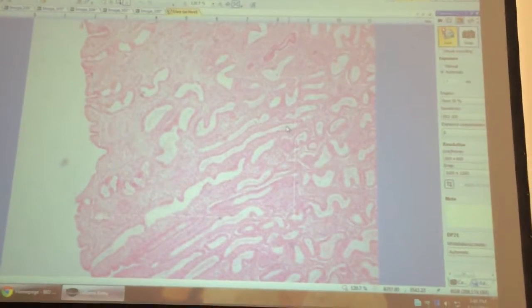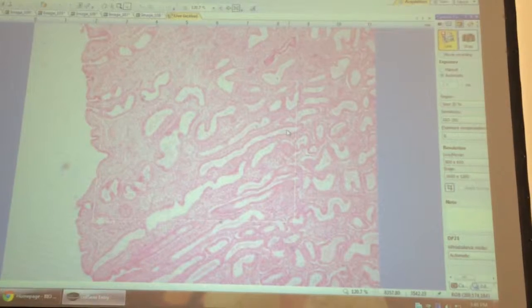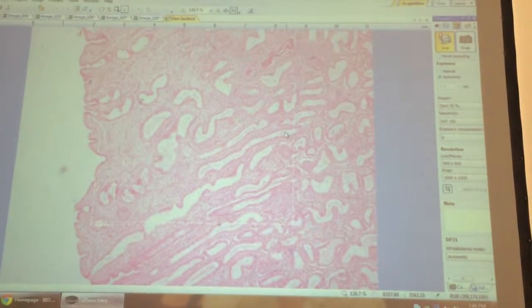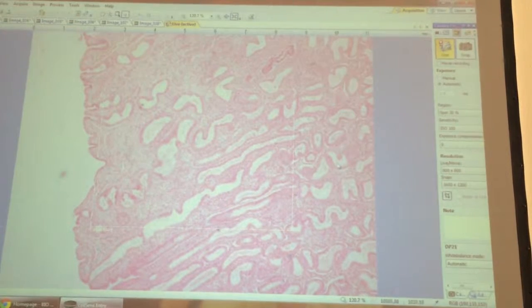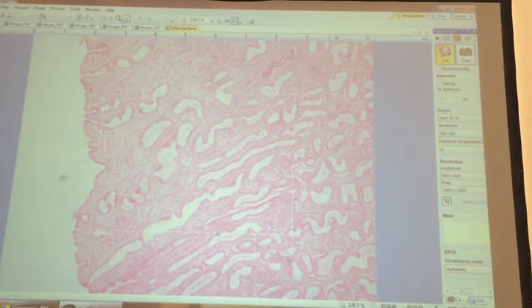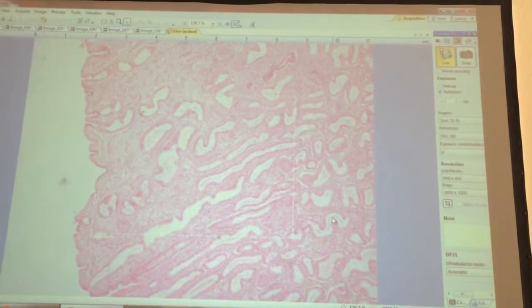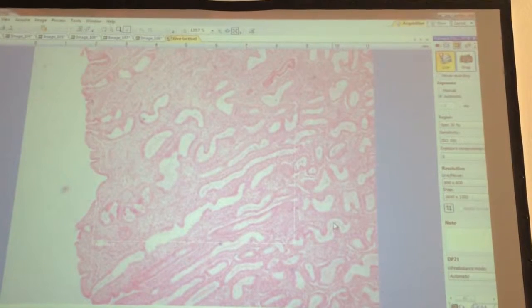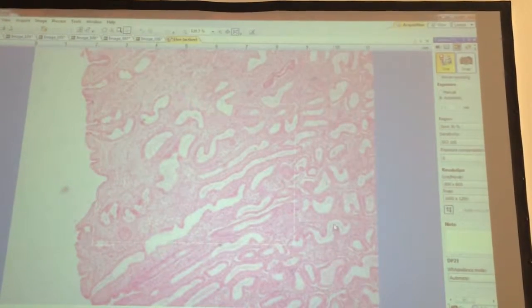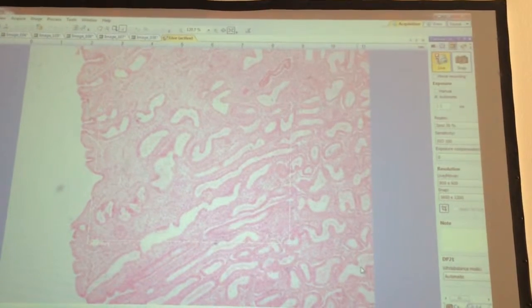If a fertilized egg implants, it implants into this endometrium, and the endometrium will support it for a while before the placenta is made. Okay? So the glands that you should see here in the secretory phase, they're secreting a lot of glycogen. Think of it that way. They're long, they're secreting a lot of supportive components for that fertilized egg. The glands look very kinked, so they should look kind of curved back and forth.